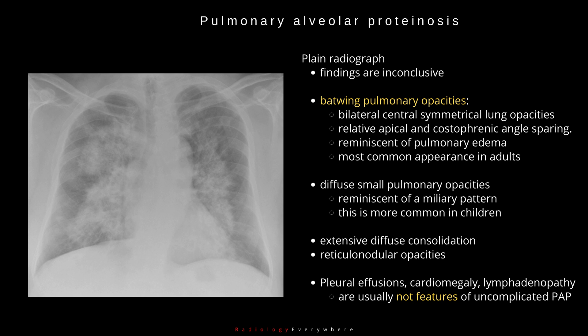On plain radiograph, chest radiograph findings are inconclusive. You can see batwing pulmonary opacities — bilateral central symmetrical lung opacities with relative apical and costophrenic angle sparing — reminiscent of pulmonary edema. This is the most common appearance in adults. The second pattern is diffuse small pulmonary opacities, reminiscent of a miliary pattern.